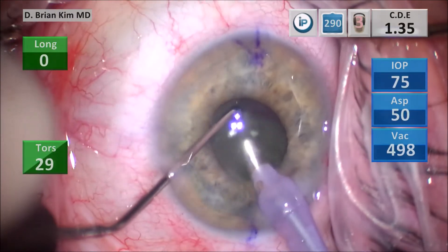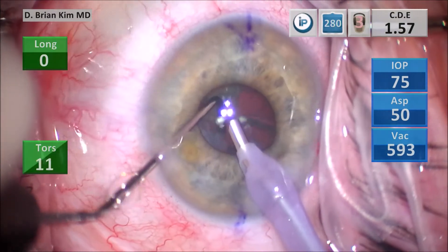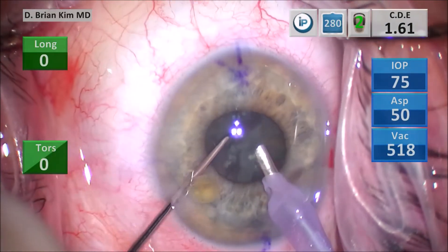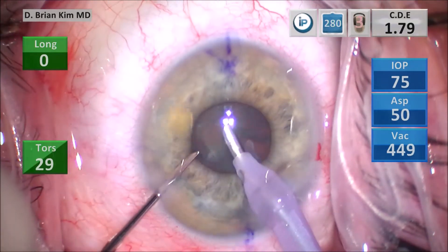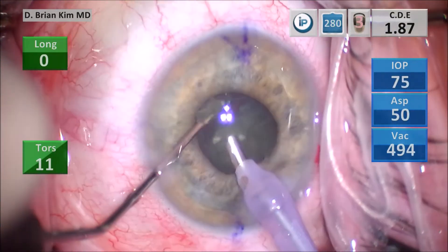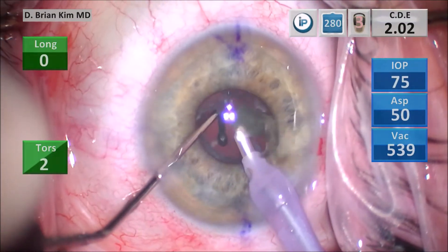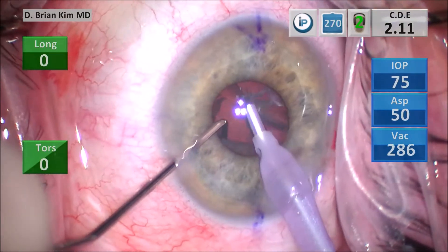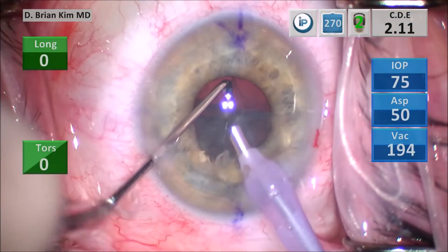That's the chop maneuver again — I always place the chopper out to the equator, place the phaco tip deep, and sandwich the instruments together to fracture the lens. This is a one to two plus dense lens, so the lens is very easy to break and the fragments separate very easily. This is a nice case demonstrating this technique. Every time I'm breaking the lens pieces, I do not use any ultrasound, vacuum, or aspiration — only mechanical forces.